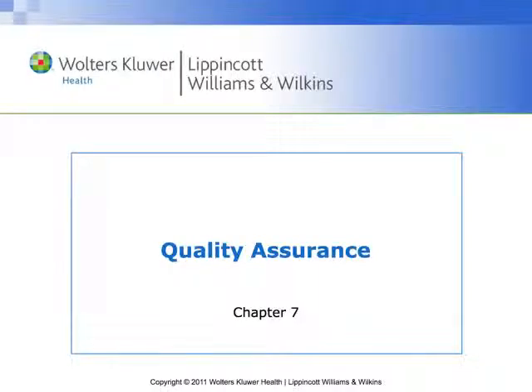Okay, let's talk a little bit about quality assurance. The basic principle here is that we're going to do quality assurance programs pretty regularly. Most facilities do them every morning before the day's work. These are tests that are recorded and then documented. We're using quality assurance to verify that we can actually produce high quality images.